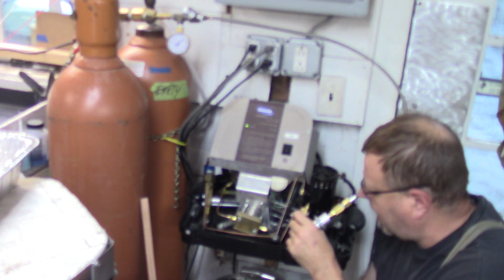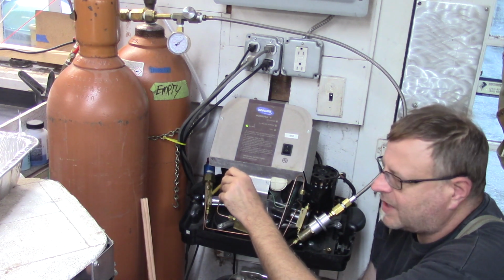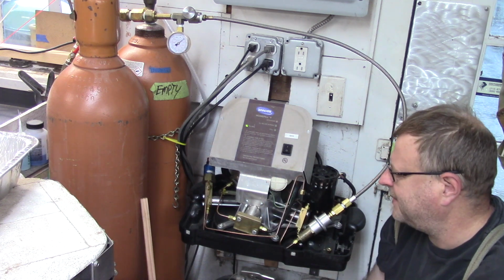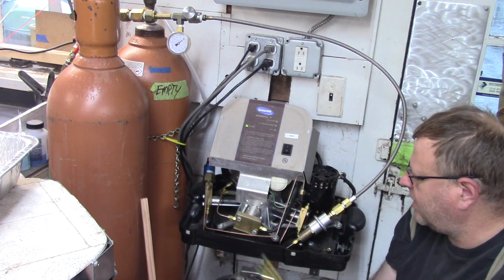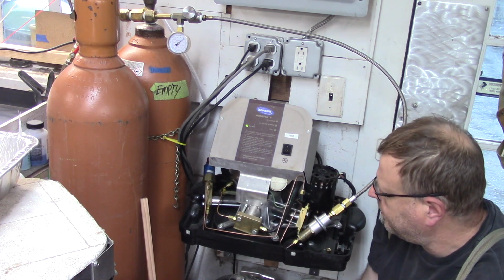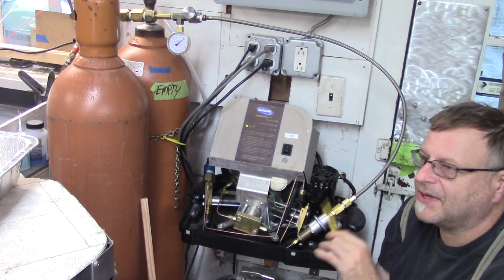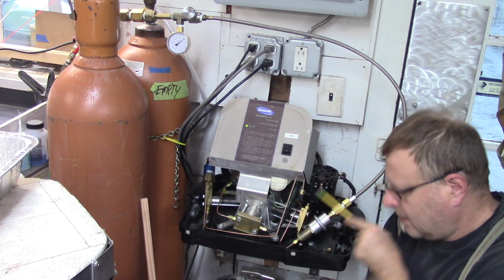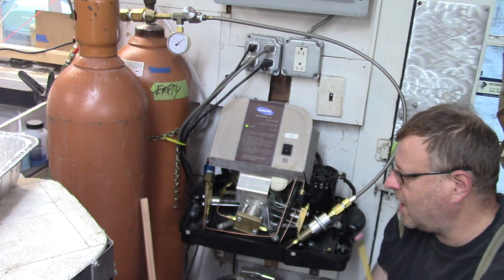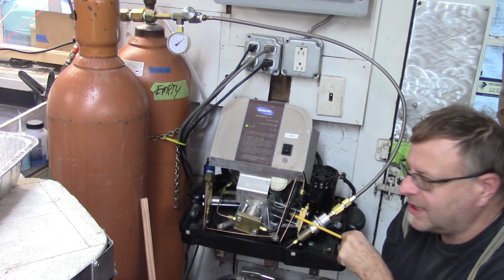What I did was I took the heads and the cylinders out of these things. I left the pistons in place because I didn't want to disassemble this thing. This also sounds like it's got a bad wrist pin, but I'm not going to get into rebuilding wrist pins on this thing. When I took the cylinders out, both of them were highly polished on the inside, which I expected, but they were also somewhat scored with something. I took some really fine non-petroleum based compound that I have for painting cars and polishing metal, and I tried to clean the bores up as carefully as I could.